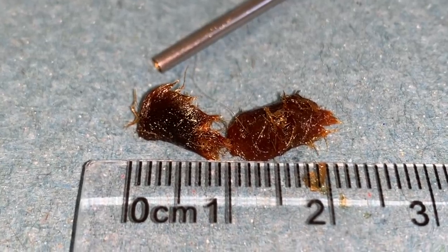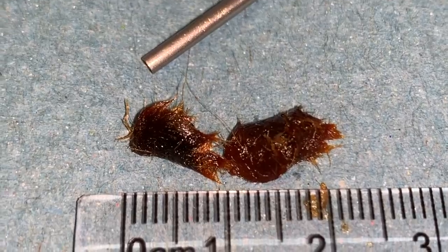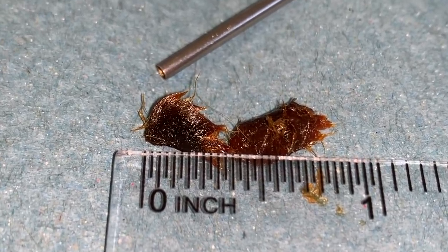Canal walls are looking nice and healthy. This is what we removed — you can see there are little tiny bits of hair in there as well, just to give you some idea of the size of what we take away.